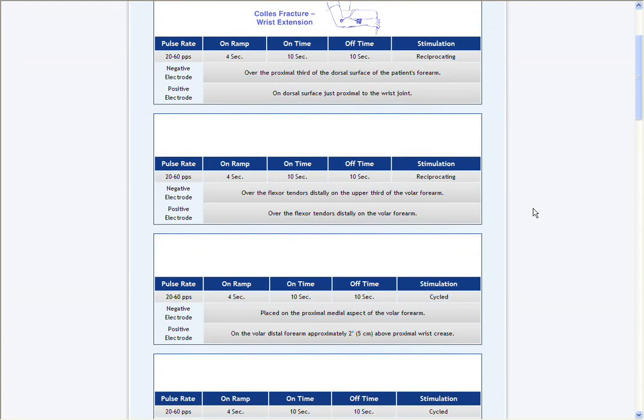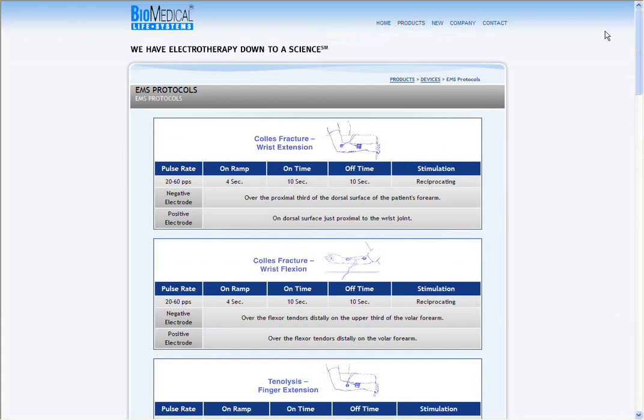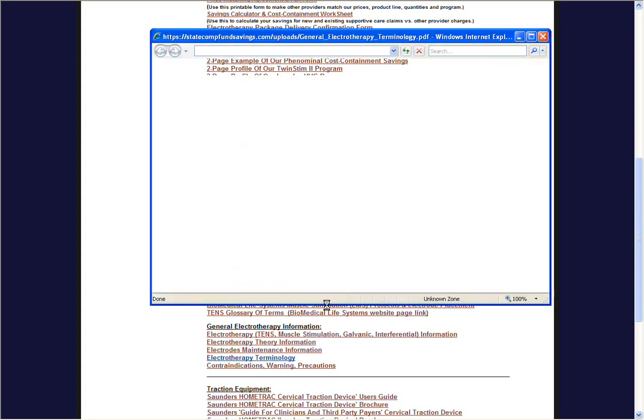Electrode placement. You can see that. Again, we're not making any medical recommendations of anything. It's just, this is a tool for your therapist or your physician to look at. Electrotherapy terminology. Click on that.